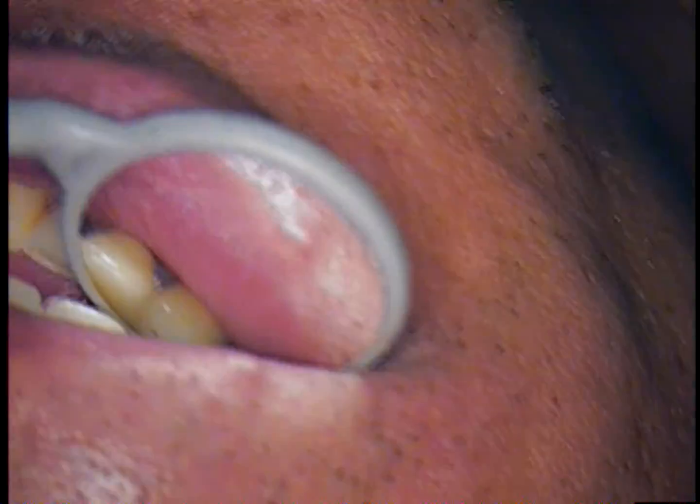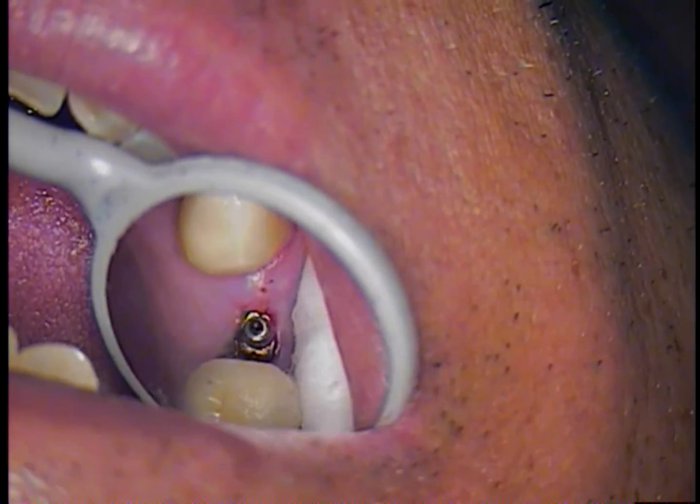We still do not know why the screw did fracture. More than likely it is the patient's bite, and we will check that at the end once we insert everything and see if there is any movement whatsoever.